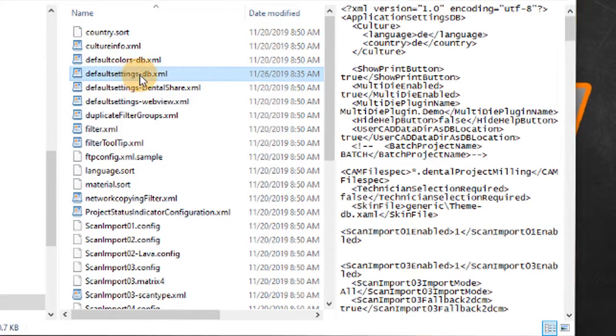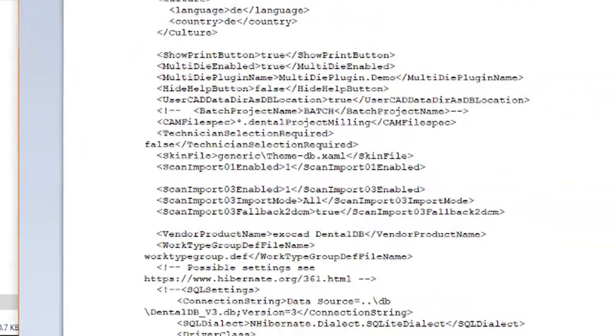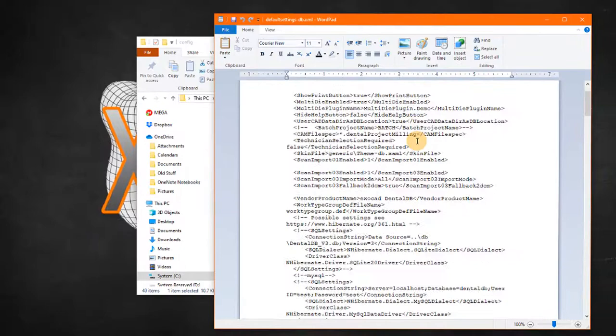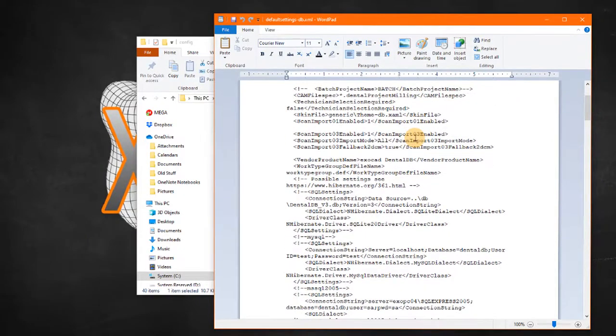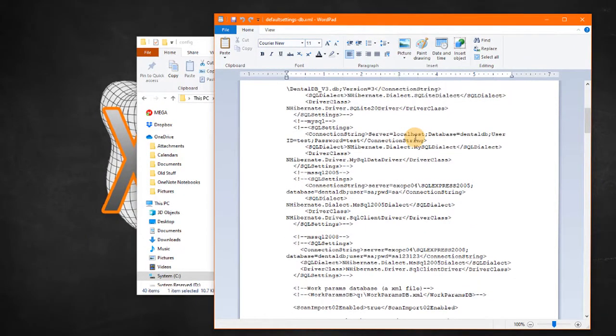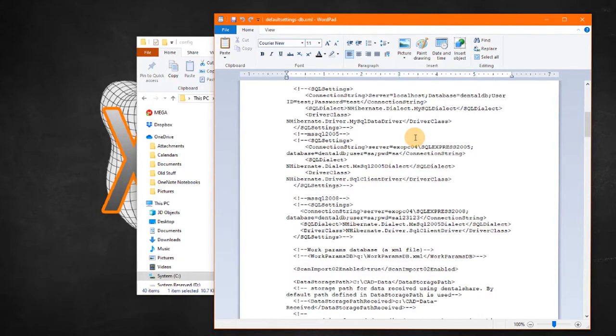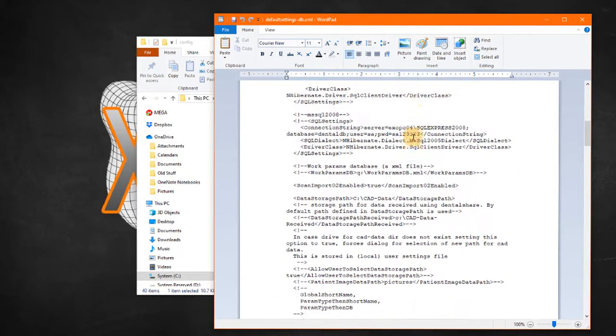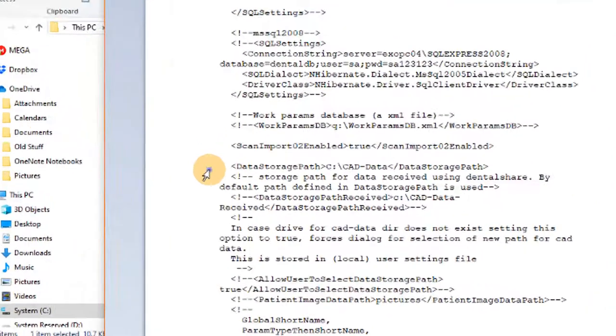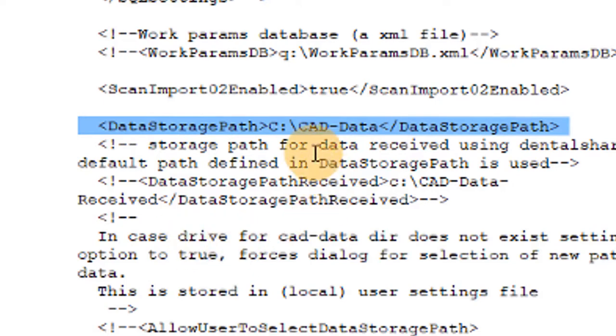So in default settings dash DB, it is an XML file but that can be edited in any text editor. So you can open it with word pad or notepad and all it is is a text file. But you can see right here the data storage path. The default setting is dot dot CAD dash data and I've changed that to C drive slash CAD data.